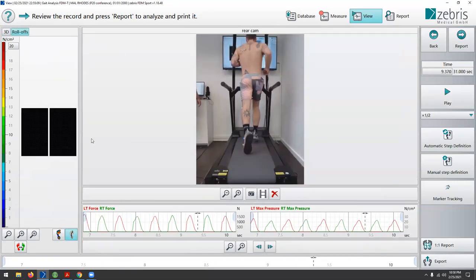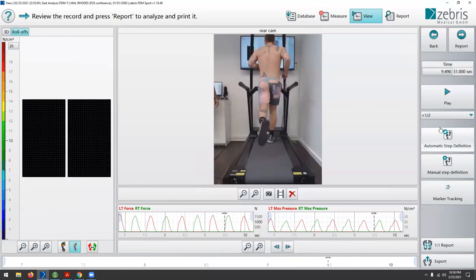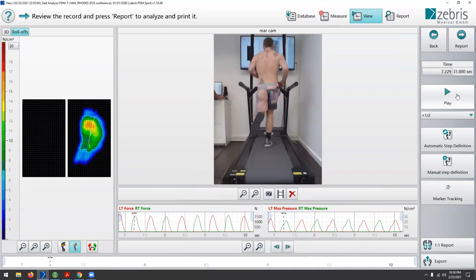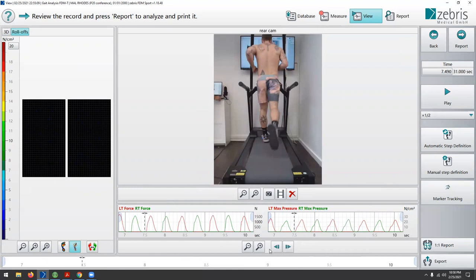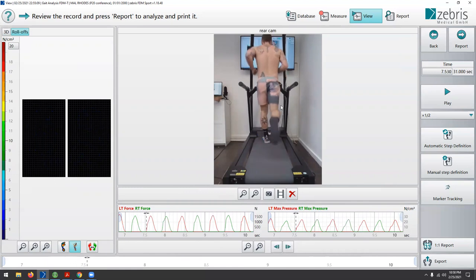From the posterior capture I always start on the left side. At left initial contact I drop a line from the midline and a line straight down from the hip joint, looking at where the runner lands relative to those two lines. We don't want a crossover sign — landing on a tightrope — but we also don't want them landing directly under the hip. We want them landing closer to the midline. This crossover sign is often seen with knee pain and ITB compression symptoms.